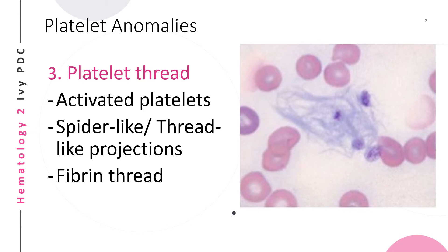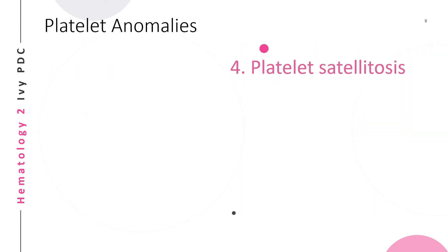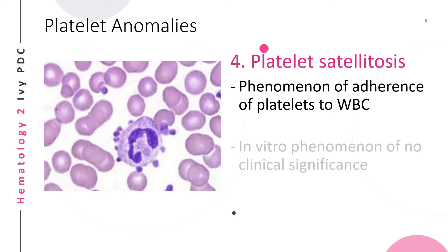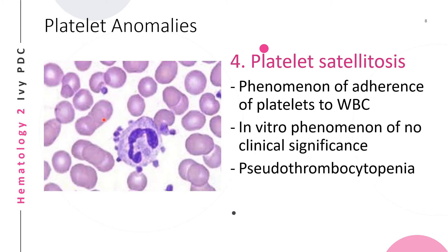The fourth platelet anomaly is platelet satellitism. This is a phenomenon where platelets adhere to a white blood cell, forming a ring or satelliting around it in vitro. This has no clinical significance, but it can cause pseudothrombocytopenia, as these platelets adhered to white blood cells may no longer be counted in the platelet count.